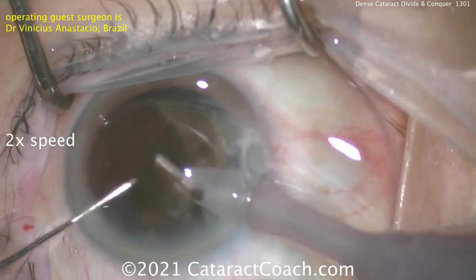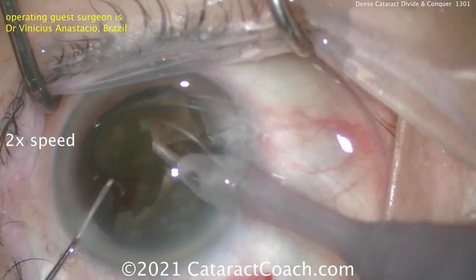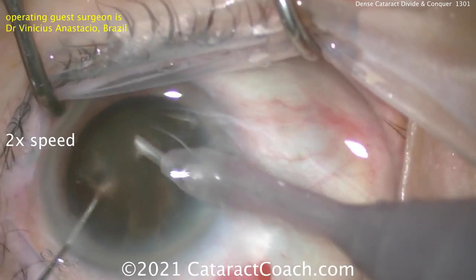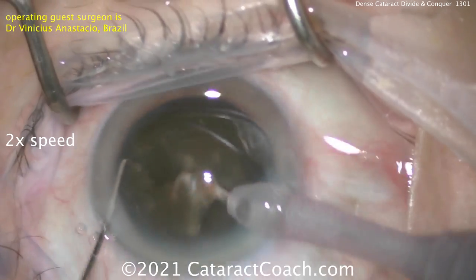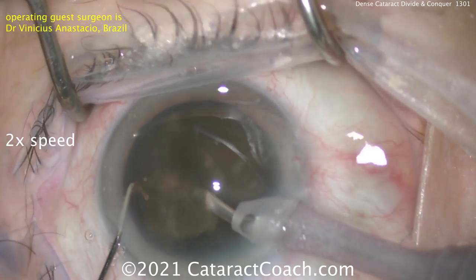Here comes another piece — and look, a little chop as well. Just because you like divide and conquer doesn't mean you can't do a little chop, and vice versa. My advice: be proficient in all the techniques. Why would you want to have just one technique in your toolbox? You want as many techniques as you can get.